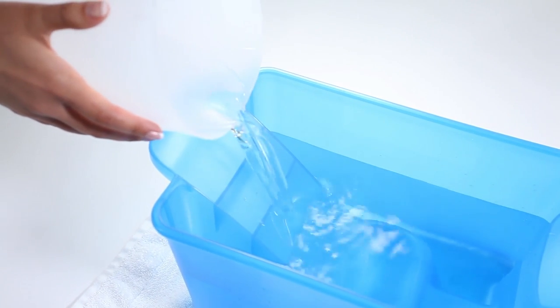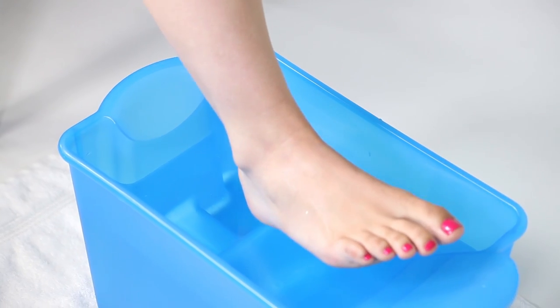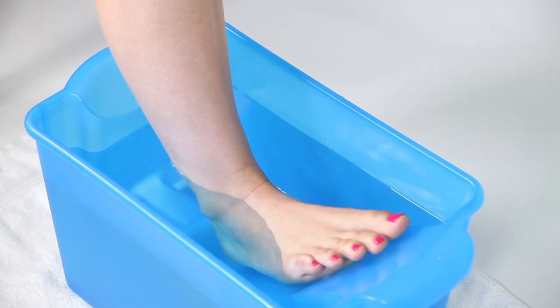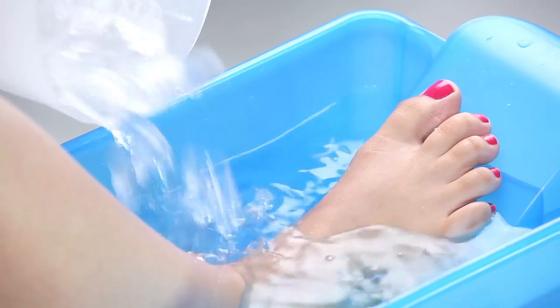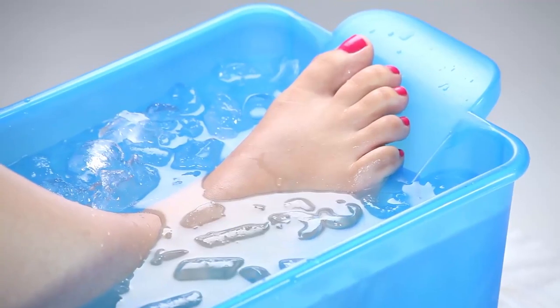For cold therapy, simply pour water to the desired fill line. Not too much now. Acclimate your foot to the water by easing it gently into that sparkling bath of healing delights. And then add ice. Be sure to save some for that after-dinner gin and tonic.